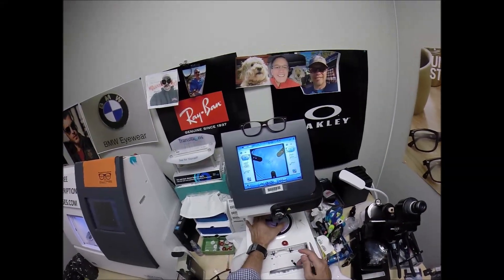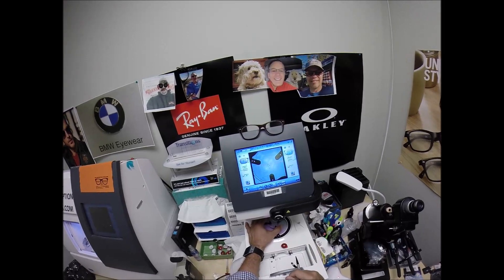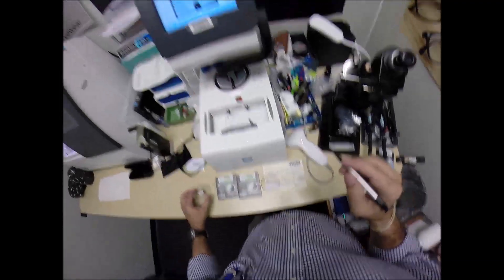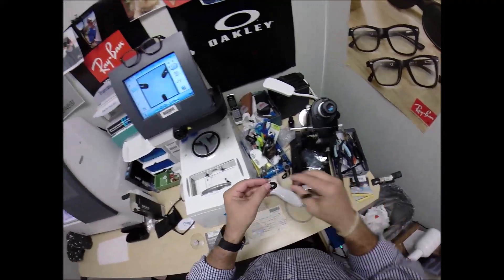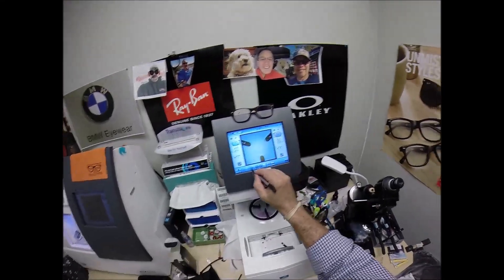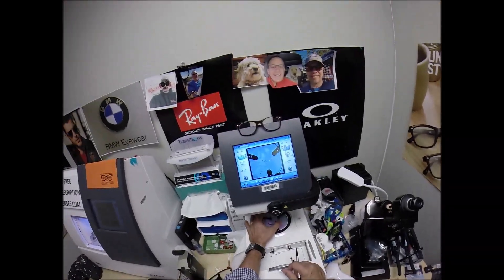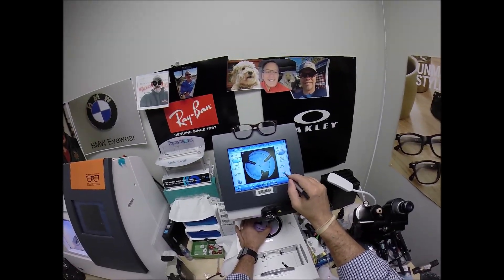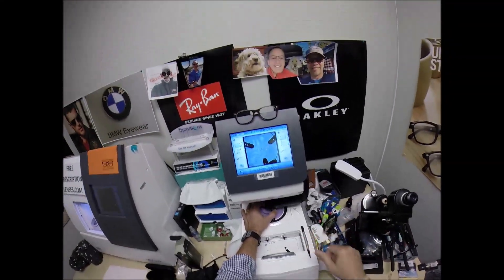Make sure everything is lined up perfectly, then hit that button. The arm is going to come down and place the block onto the right lens. We're going to do the same thing now for the left lens — pull the paper away to make the black side sticky, line up the magnet, check the pupillary distance, get everything lined up exactly the way it should be, then hit that button. The arm comes down and places the block onto the left lens.